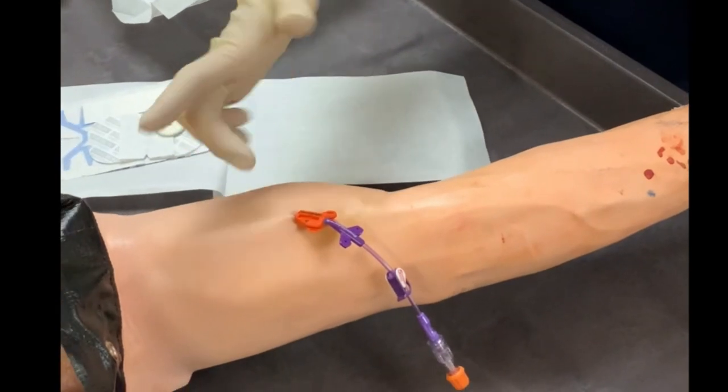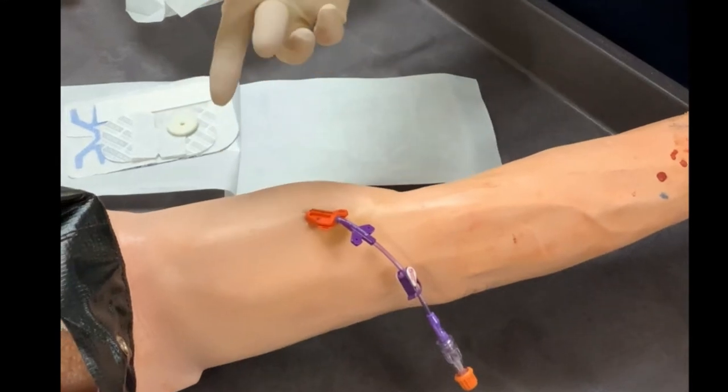Touch the arm with your gloved finger, not at the insertion site, but somewhere near it that you had disinfected. If it is dry, you can proceed with the dressing application. If it is not, continue to wait. If you try to put the dressing over wet chlorhexidine, it will likely not stick, but it could also likely cause a rash to form under the dressing that will be itchy and painful.